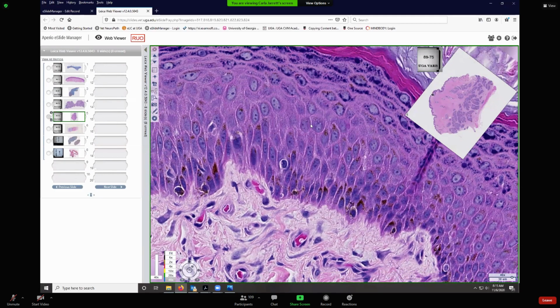And that's because we get shrink artifact between the cells in these intercellular spaces. And the shrink artifact exposes the little linker proteins that span that intercellular space between the desmosomes. And the desmosomes are connected to that intracytoplasmic cytoskeleton inside those cells. Sometimes you can even see those spinous processes down here between these cells of the stratum basale, because they also have desmosomes between themselves, and then they have hemidesmosomes where they attach to that basement membrane.